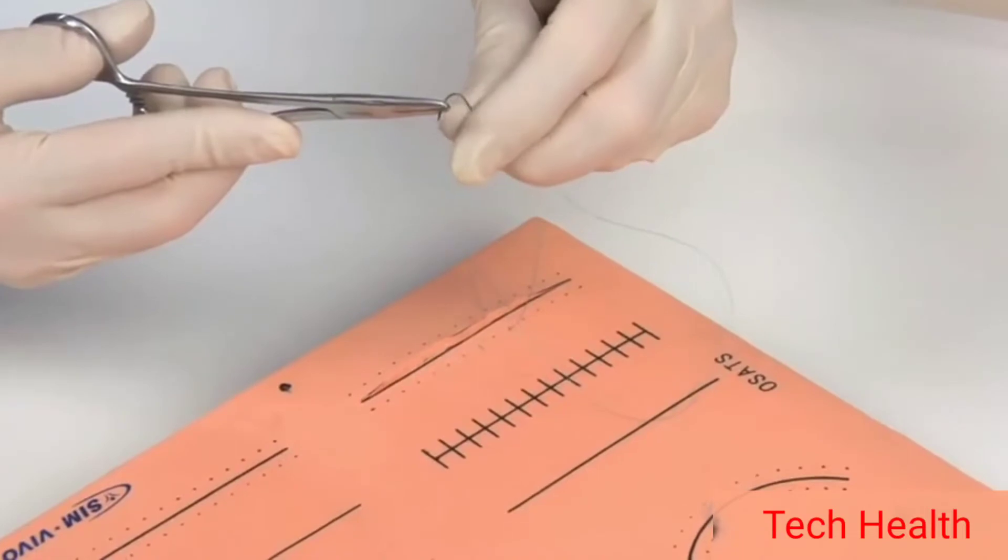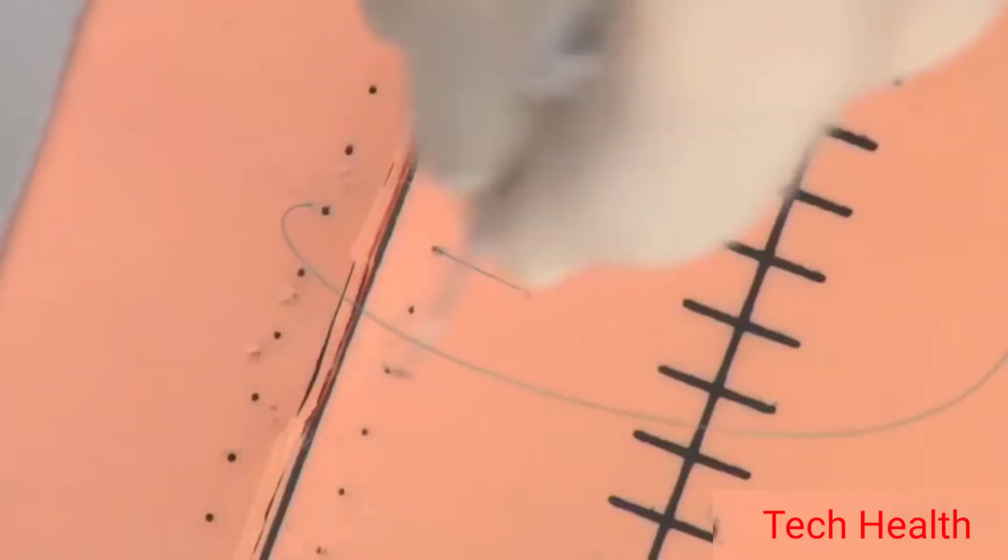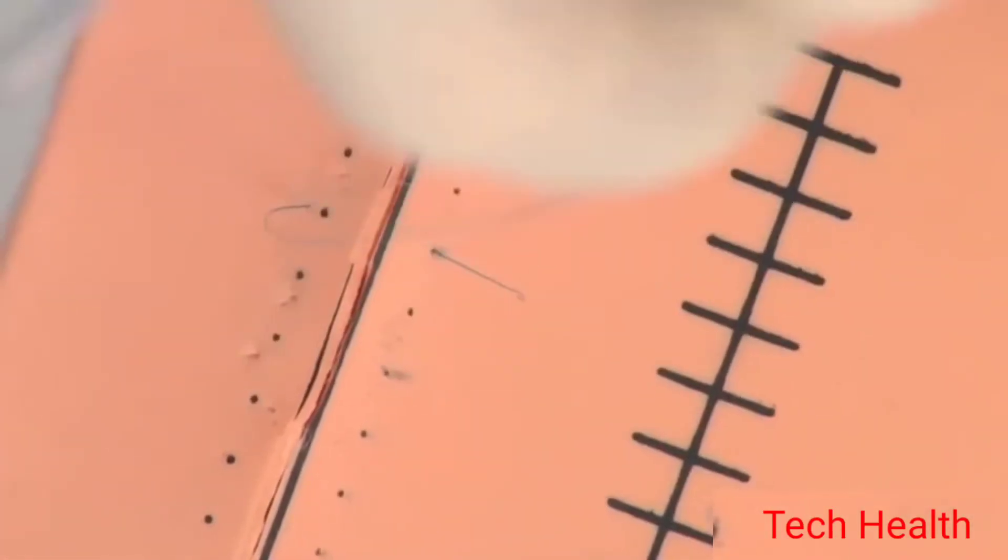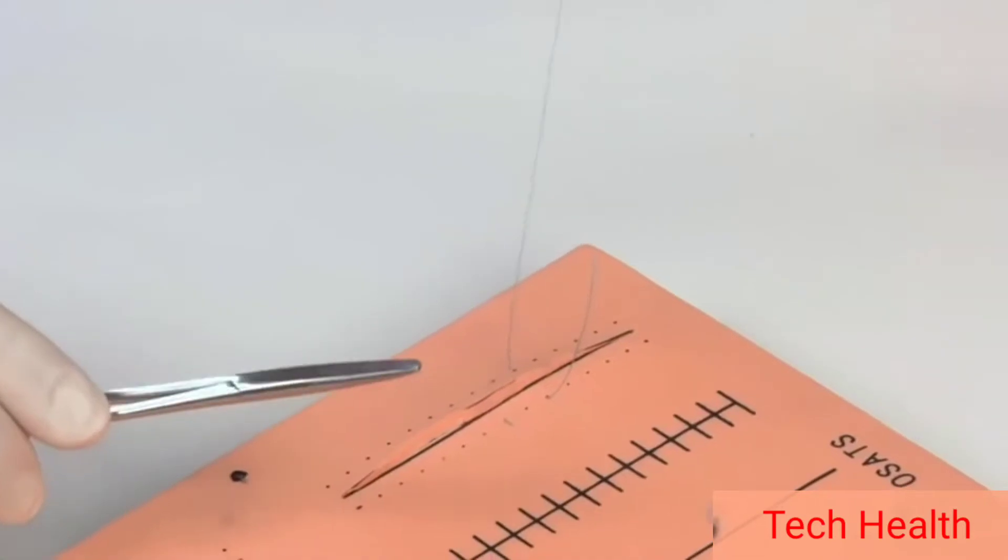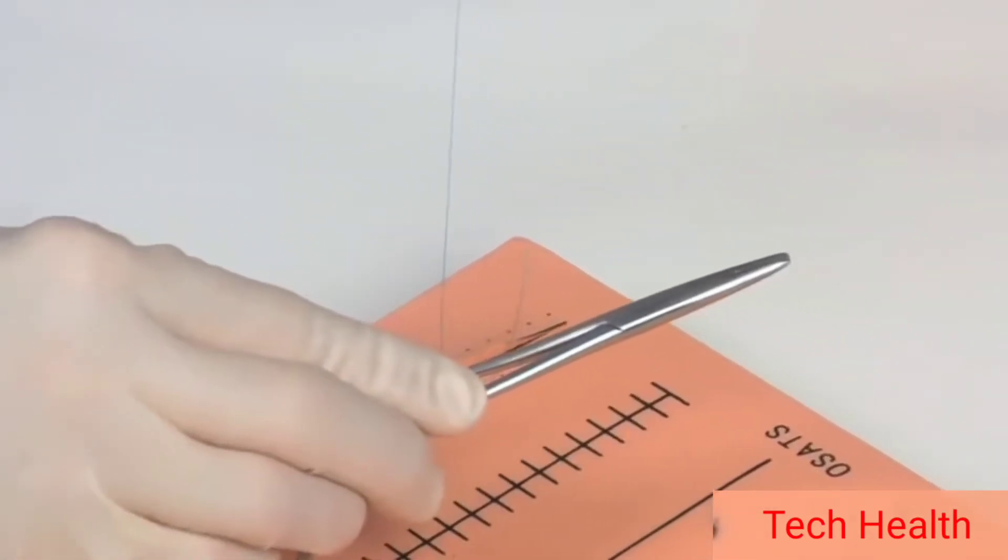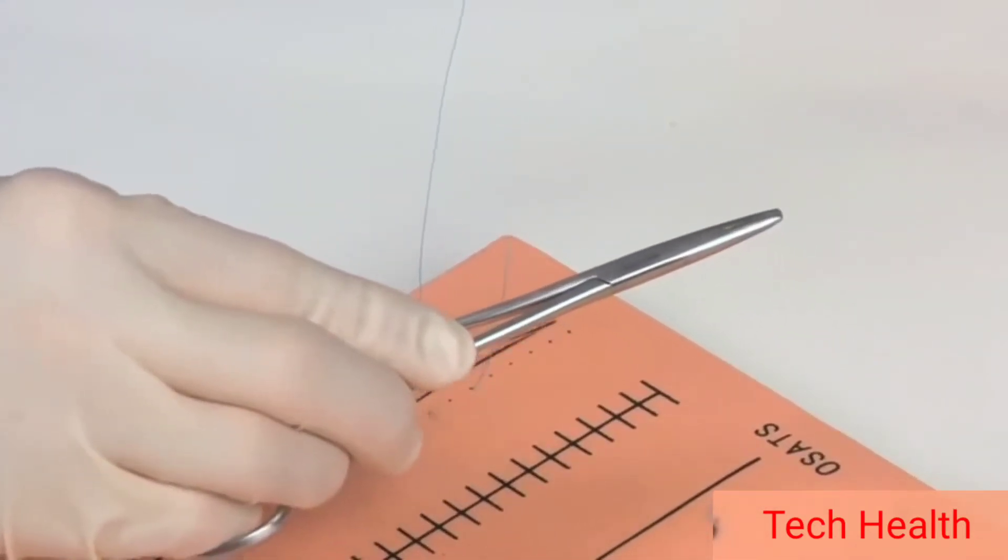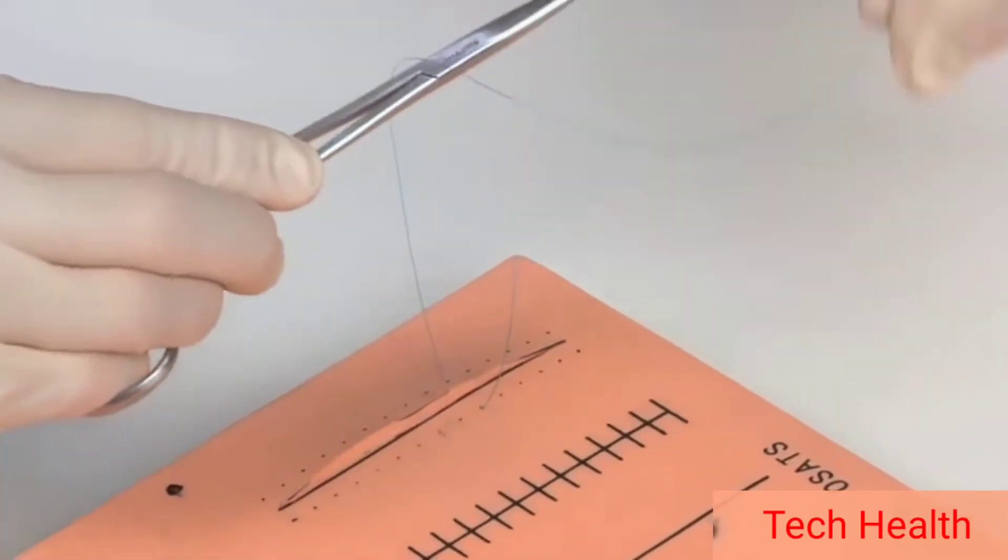Grasp the suture away from the end of the needle. Lift straight up. Start away from yourself with the needle driver and bring it into the long suture while going around it twice for the first throw of surgeon's knot.